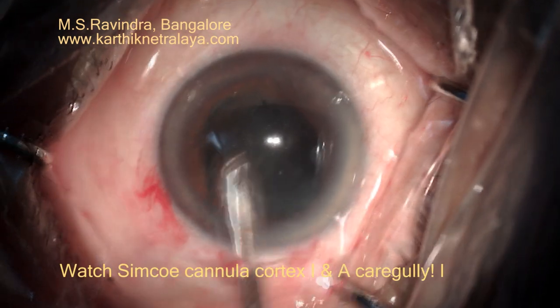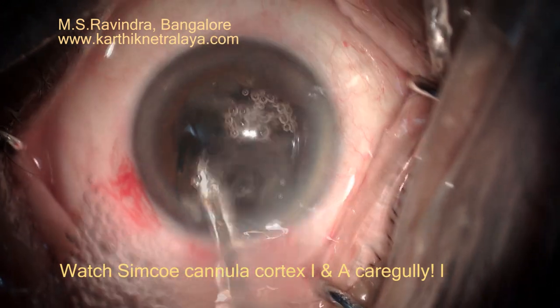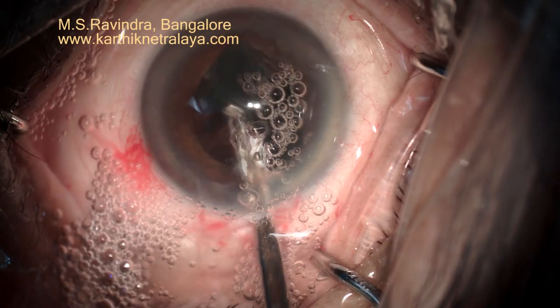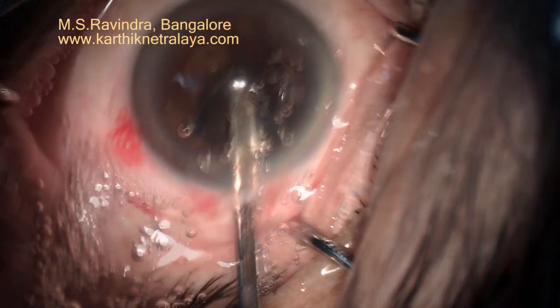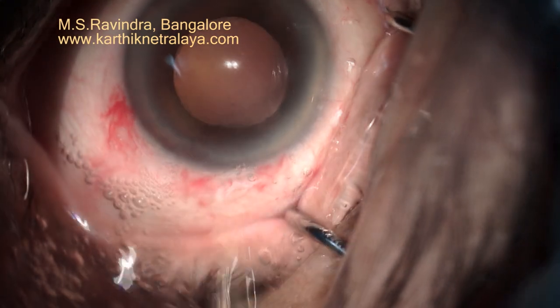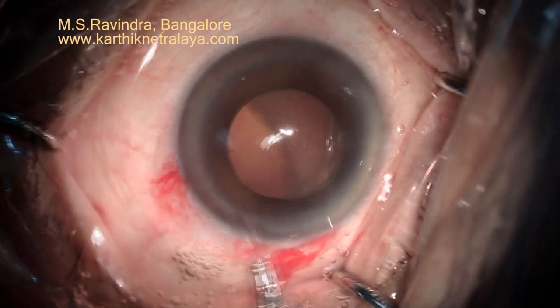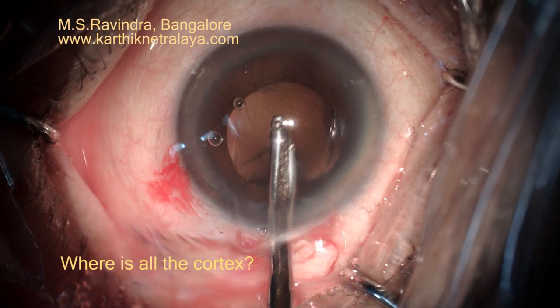Cortex is aspirated gently with the Simcoe cannula. Suddenly, the entire material comes out and I was surprised to see a very clear view without any cortex being present. I suspected that the capsular bag might have come out.